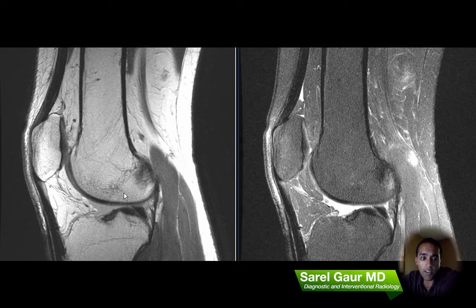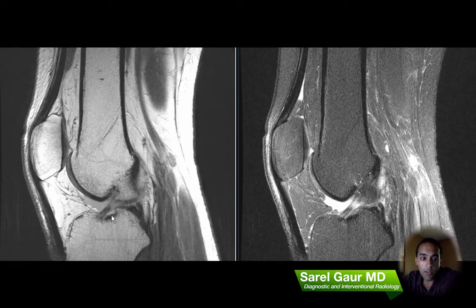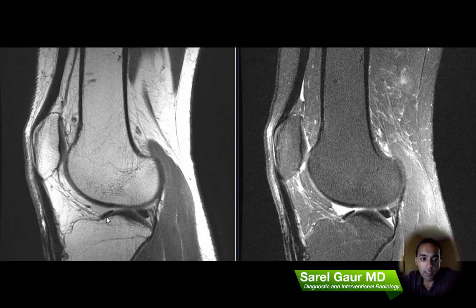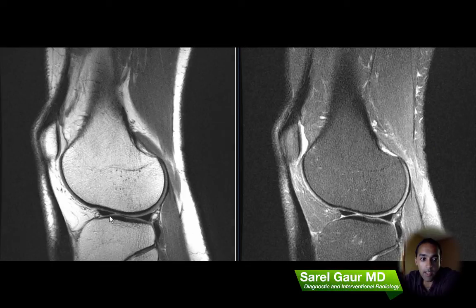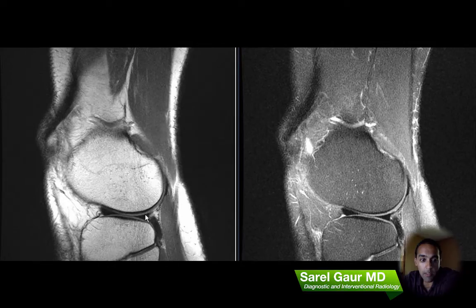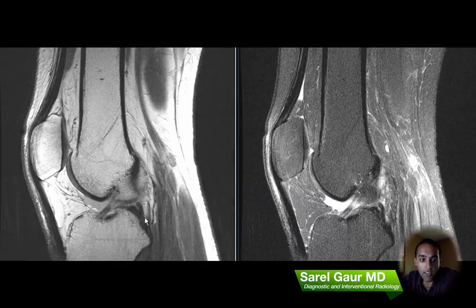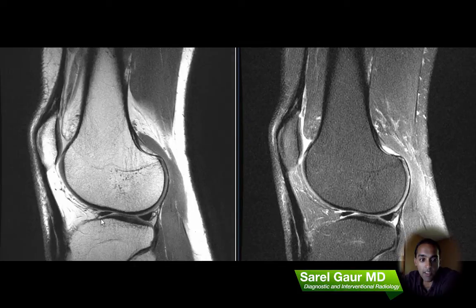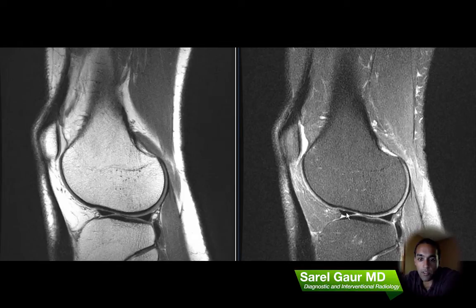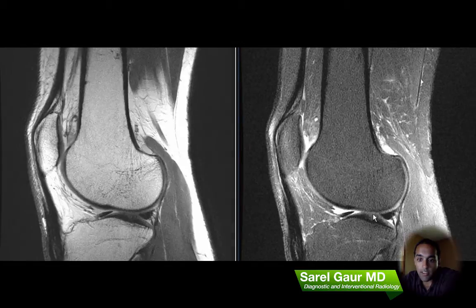I'm going to start looking at the menisci, beginning with the lateral meniscus. Here I can find the root of the lateral meniscus — this is the anterior horn — and I'm seeing this as a dark black triangular structure, which is normal appearance. I trace that out to the body segment and then come into the posterior horn and trace that to the root. I'm basically looking for any evidence of a tear, also using the fluid weighted sequence to see if there's any fluid intersecting between the fibers. I'm not seeing any evidence of tear.